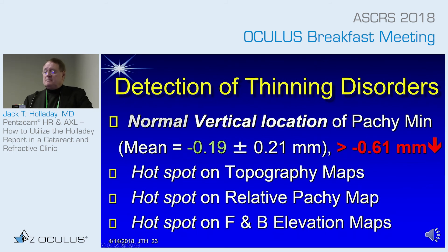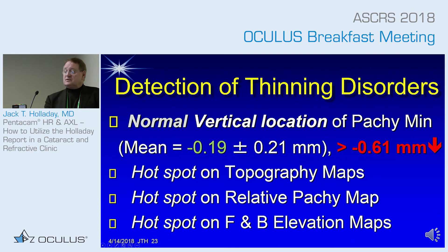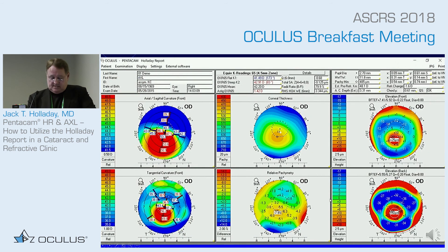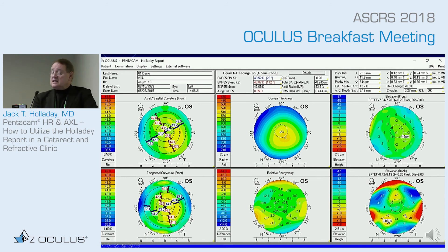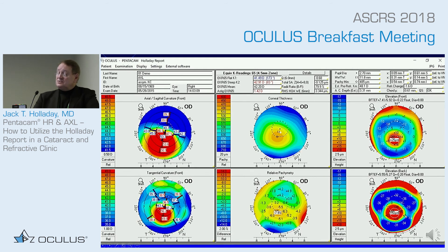In thinning disorders, one hallmark of keratoconus is a pachymetry minimum whose Y position is much farther inferior than normal. Normal is about 0.2 to 1 tenth of a millimeter below center, but in keratoconus it's often 0.6mm or greater inferiorly. Looking at a case: there's no red on the topography map — it's yellow — with slight inferior irregularity. The relative pachymetry shows some yellow inferiorly, and there's a small elevation bump. It looks suspicious until you look at the fellow eye, which shows frank keratoconus. The first eye was forme fruste; always look at both eyes since keratoconus is almost always asymmetric.